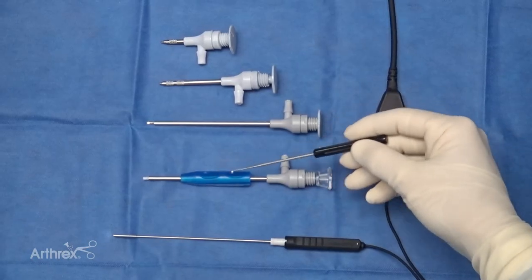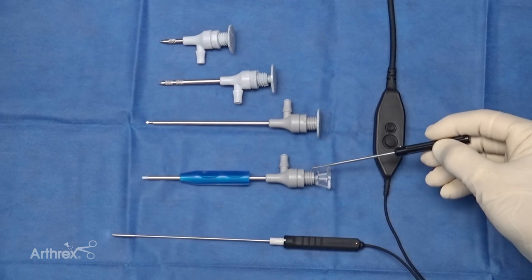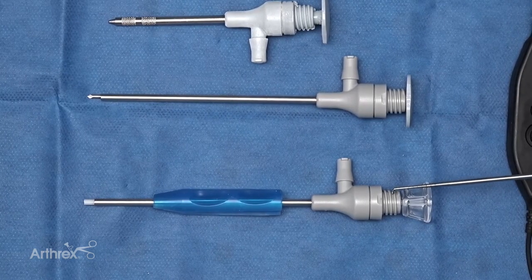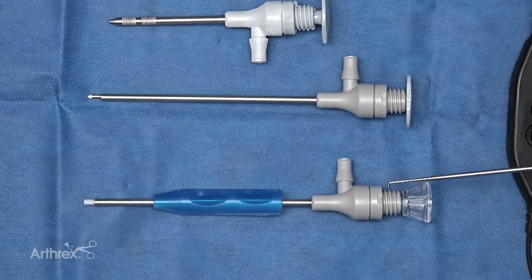We've continued to use our pencil grip, which allows you to hold it and make ergonomic motions much better and smoother. The clip-on system is what really makes the system different and much improved from our previous system, where the camera will no longer piston, and other devices and cannulas will be able to click on and adjust, allowing the surgeon to continue working.